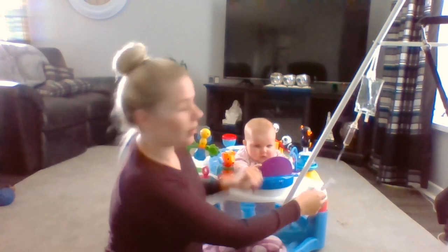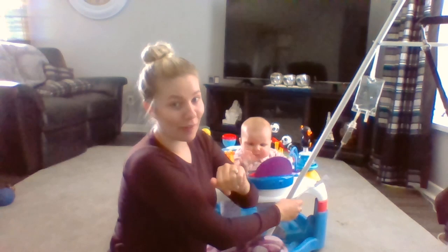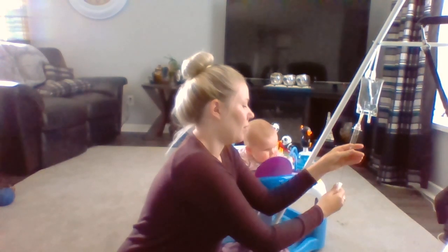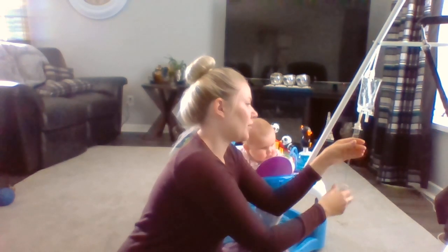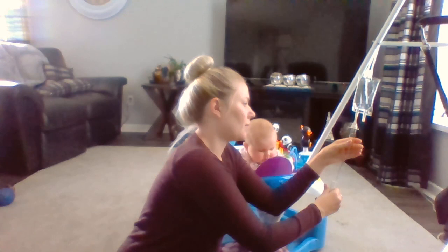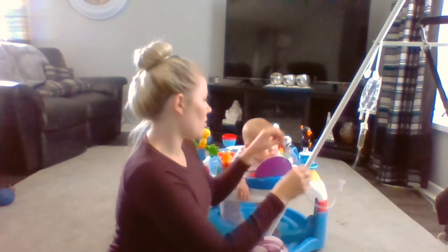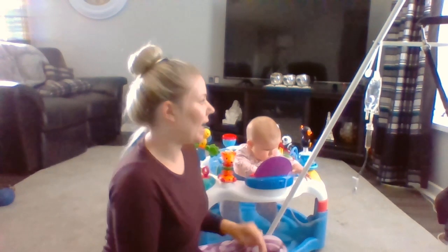For the purpose of this video, so you're not standing there watching me count for 60 seconds, we're just going to make pretend. So 60 seconds, you count the drop rate, and you want 42 drops per minute. Once that's done, you're all set to go. And this whole bag will be infused over 4 hours.